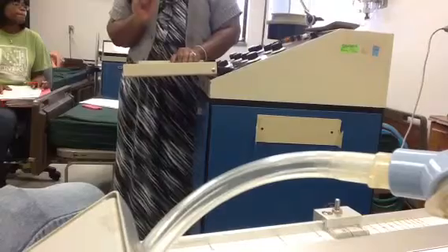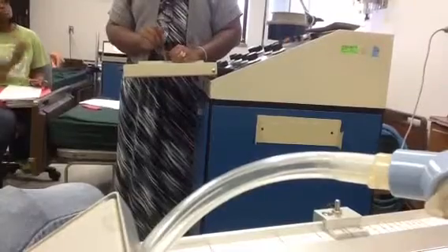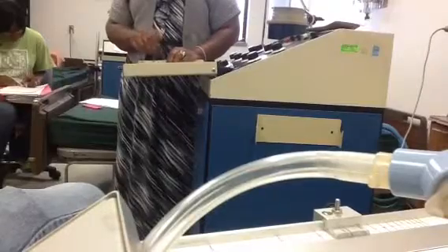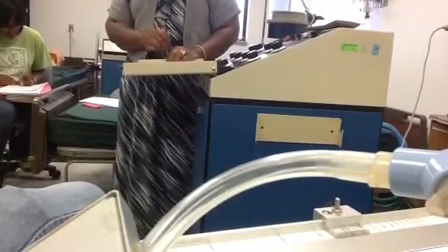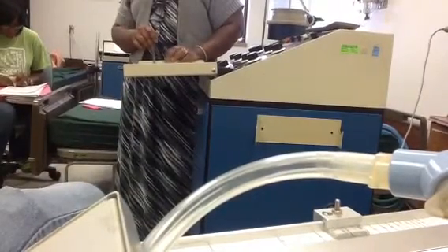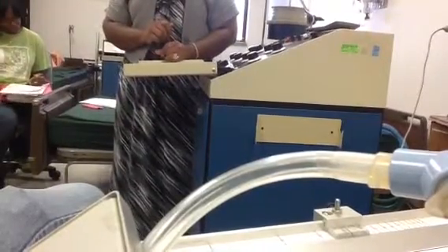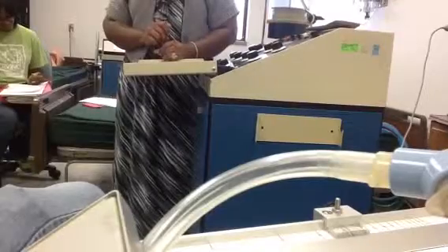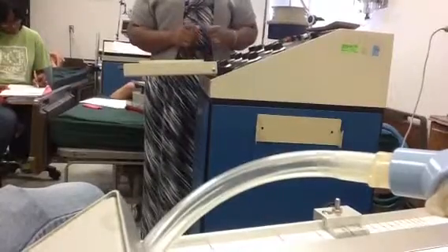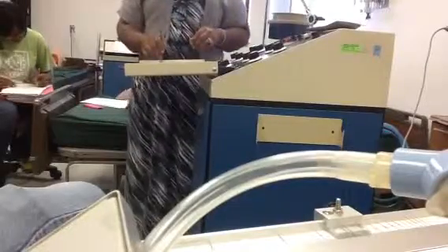They trigger breaths, but it's not a true spontaneous breath. If their rate changes, that means their minute volume can change, so it may not necessarily be what you set. You will find that by multiplying the total rate by the delivered tidal volume, which is also corrected tidal volume. PIP is what you read during a normal breath on the pressure manometer. We've already said a couple times that was 15.